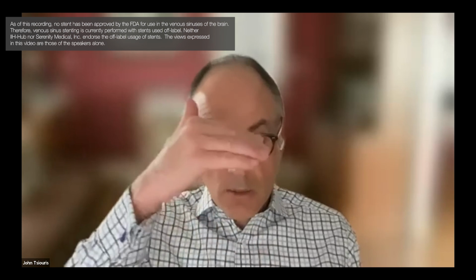So these arachnoid granulations, Meckel's caves, the cribriform plate, where the bone is the thinnest normally, is where you're going to get these chronic pressure erosions, and that's where we, as neuroradiologists, are trained to look at those areas specifically to look for these cephaloceles, dehiscence, CSF leaks, because we know they do occur in chronic IIH patients.